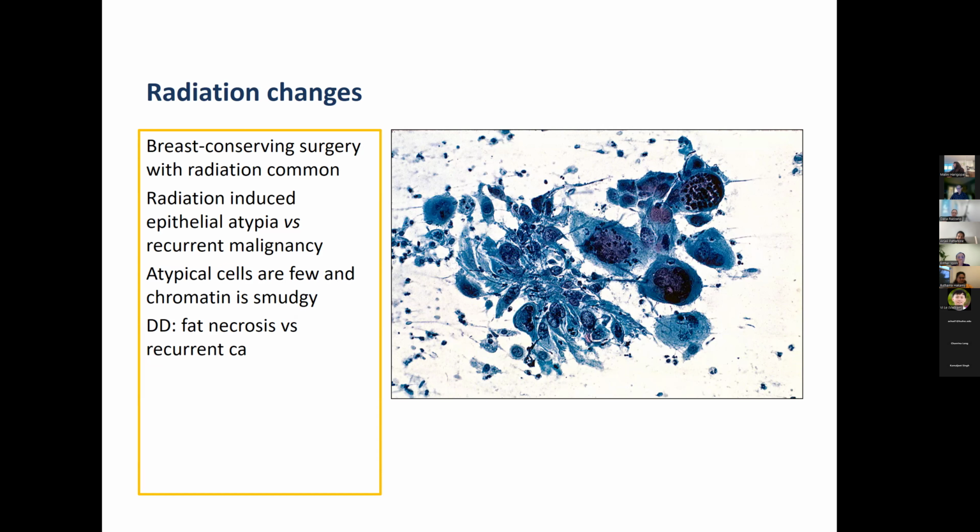There is also inflammation in the background, and there will be characteristic multivacuolation of these cells. There'll be multinucleation, and lots of vacuoles are another feature, but you will also see this kind of very reactive process. So this can be a very important diagnostic pitfall, especially when the patient has a history of breast cancer. And when you start looking at these cells, you might call these really atypical cells as positive for malignancy. So be aware, and obtaining history of radiation would be very key in this type of situation.